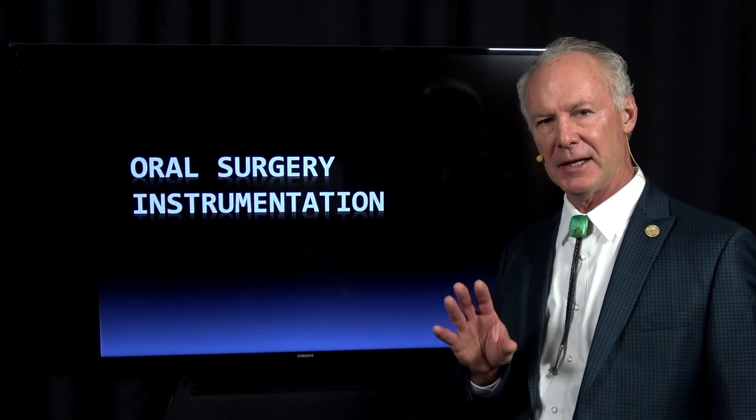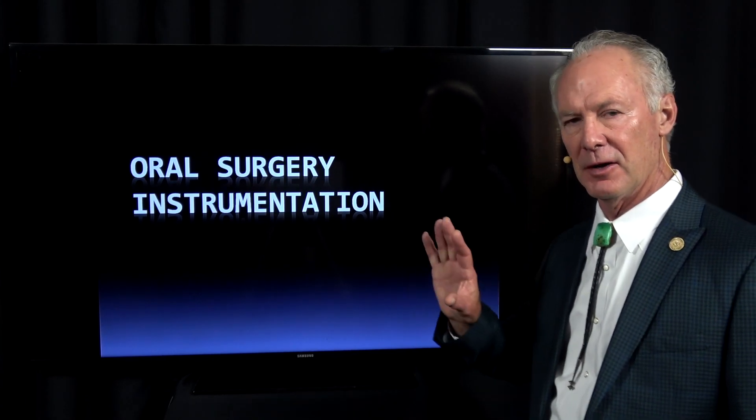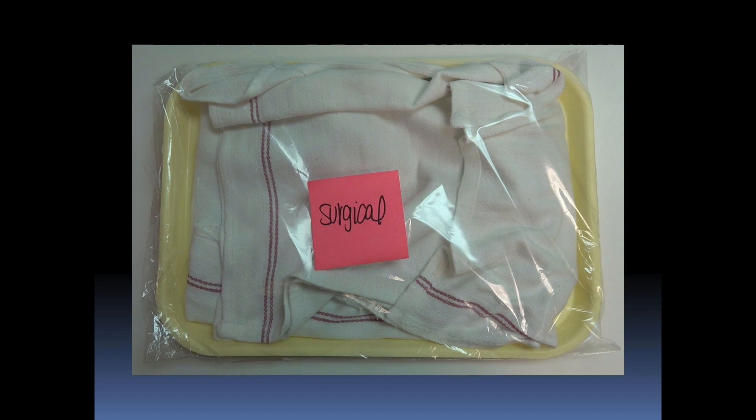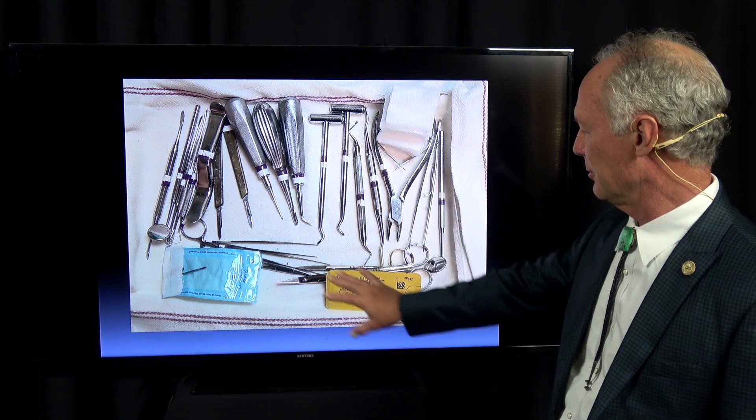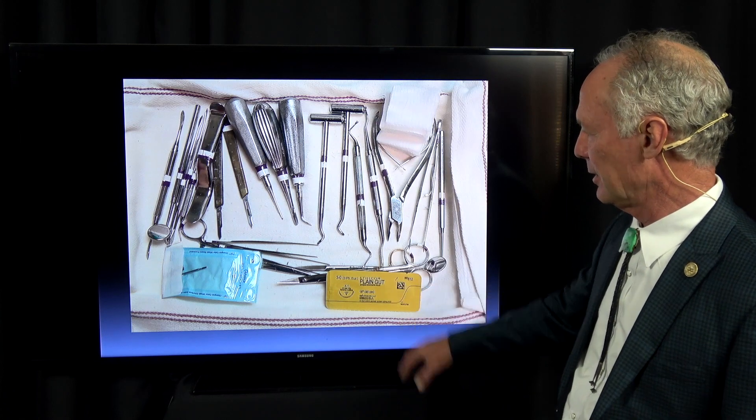Hello, several of you have asked to see a video on our oral surgery instrumentation. Now this is not periodontal surgery instrumentation, this is oral surgery, meaning tooth extraction and grafting. This is our sterilized surgical tray and these are the sterilized surgical instruments and the materials that we use.